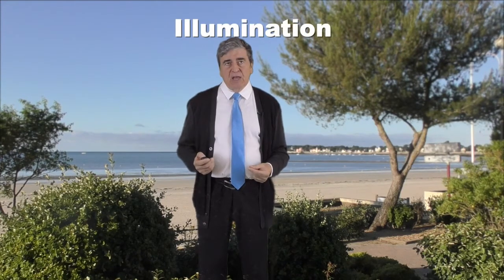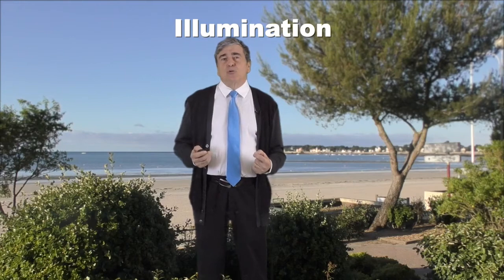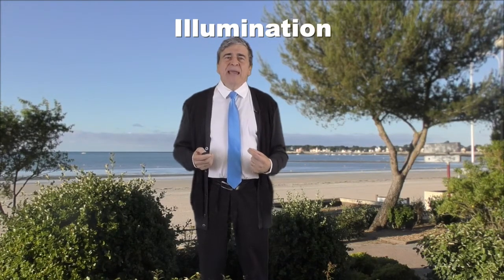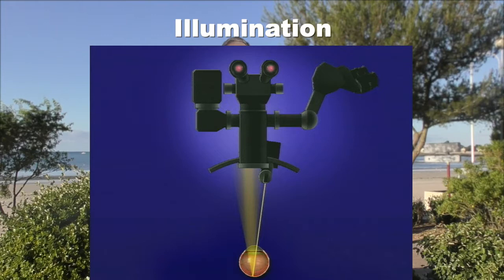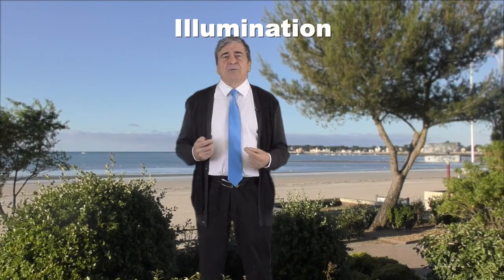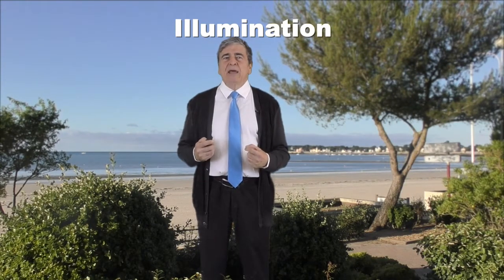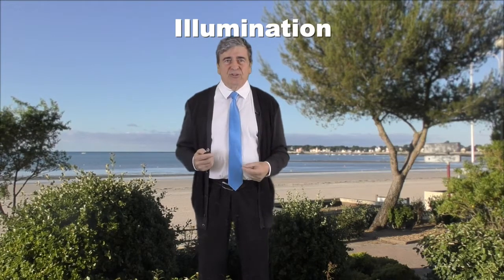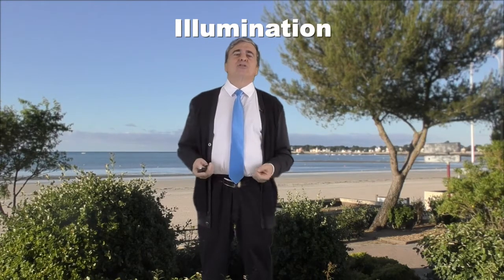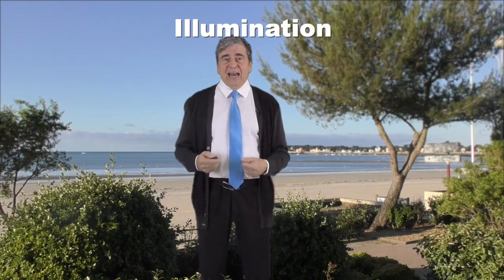Let's start with the illumination. The 17 to 18 thousand ILM peelings I made during my career in Nantes were made under the sole illumination of the slit lamp of the operating microscope. I have not used an optical fiber more than 10 times for this type of surgery, and I never understood why there are not more operators outside France and Japan using the slit lamp for macular surgery, as it has so many advantages.